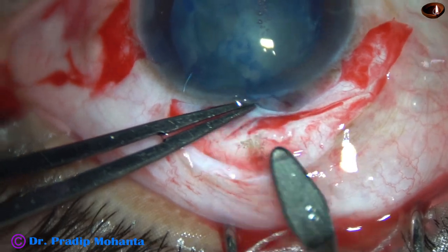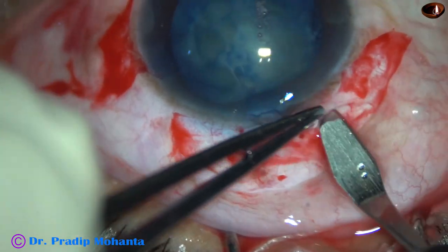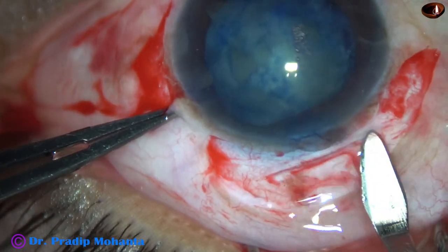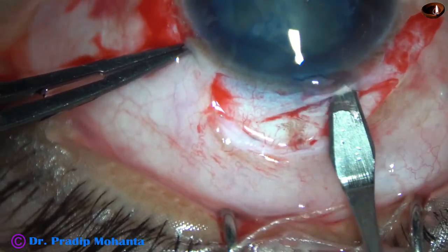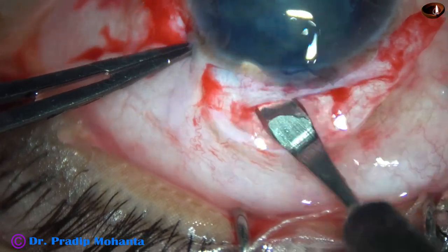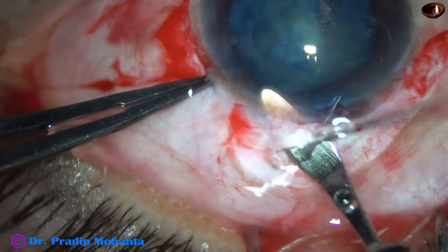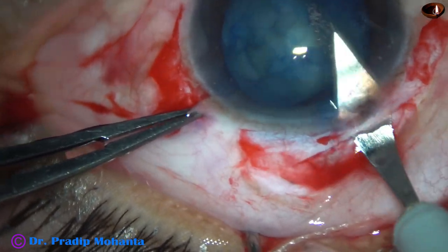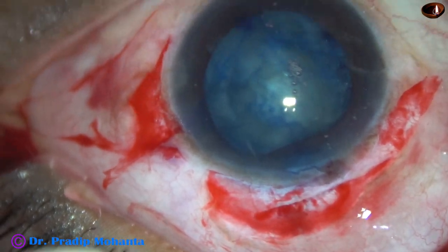I have done peritomy and now I am making a sclerocorneal tunnel. My plan is to deliver the nucleus through this tunnel, and then manage the cortex by three-port vitrectomy. The size of this tunnel is about 5.5 to 6 mm.